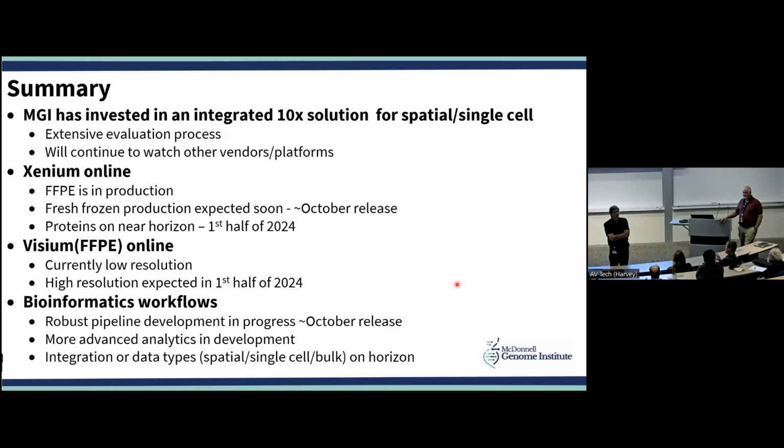Yeah, I don't know why it wouldn't. I need to follow up with 10x. They actually sent me a slide where they've got a grid of different cores that they gridded out, recut, and put down. It looks great. And that almost seems like a better way to do it than trying to take a section from each one and lay them down nicely and not get anything overlapping.